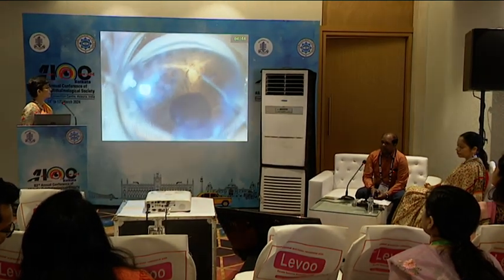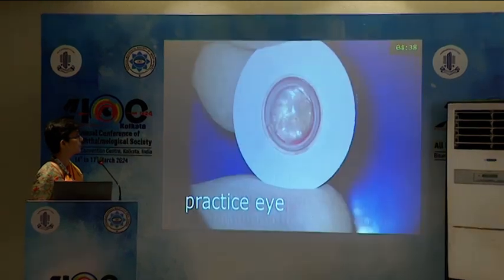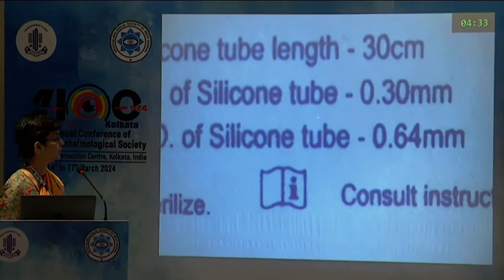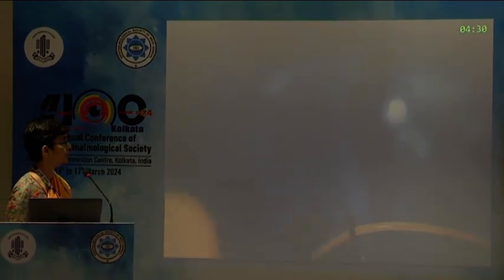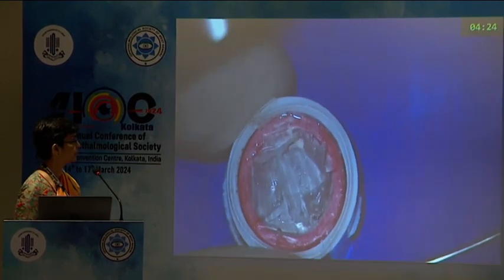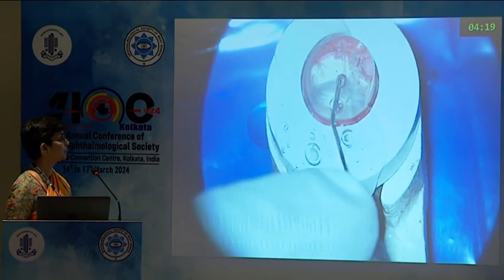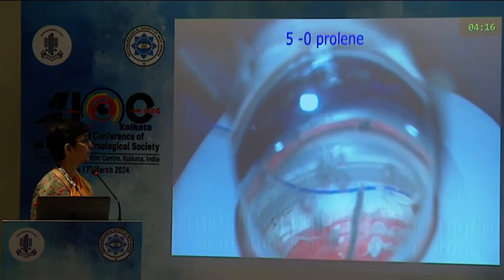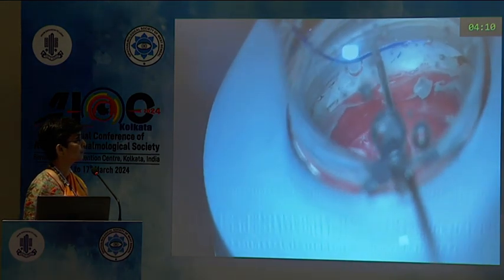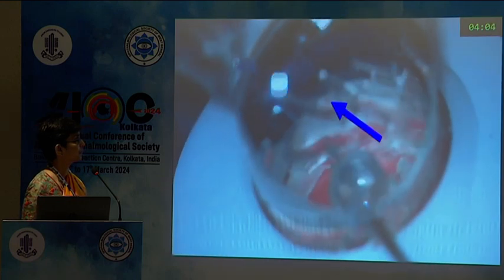Davinder Grover of the Glaucoma Associates of Texas was the first to describe suture GATT. A practice eye, already used for phaco training, is dismantled. A leftover silicon tube of a DCR intubation set with an inner diameter of 0.3 mm is glued to its surface, leaving a gap between the two ends. The leading end of a 6 cm long 5-0 proline bit is passed through the side port. 25 gauge microforceps introduced through the main wound helps to thread the proline into one of the cut ends of the silicon tube.